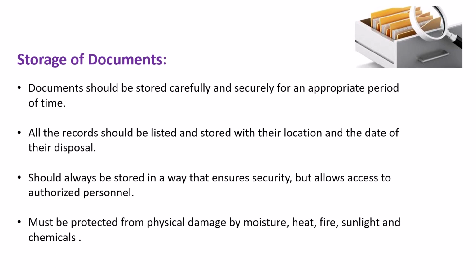Storage of the documents. The documents should be stored carefully and securely for an appropriate period of time. All the records should be listed and stored with their location and the date of their disposal. They should always be stored in a way that ensures security but also access to the authorized person, and must be protected from physical damage like moisture, heat, fire, sunlight and chemicals.